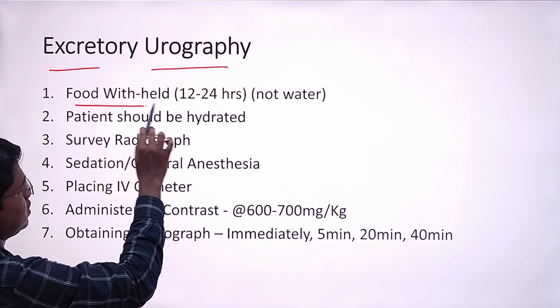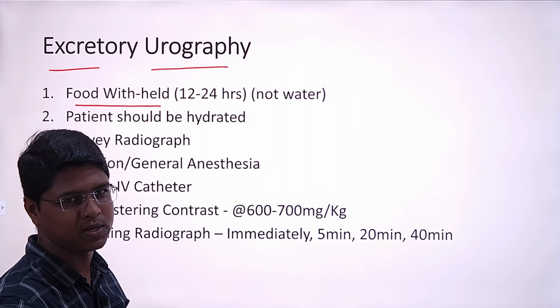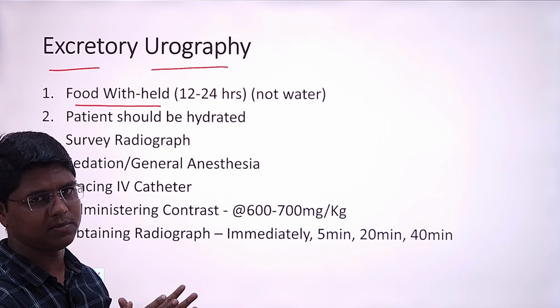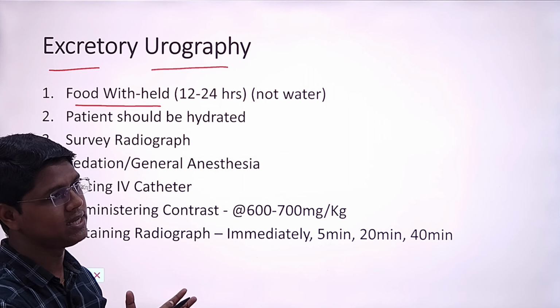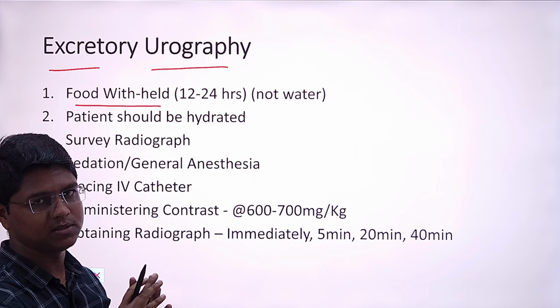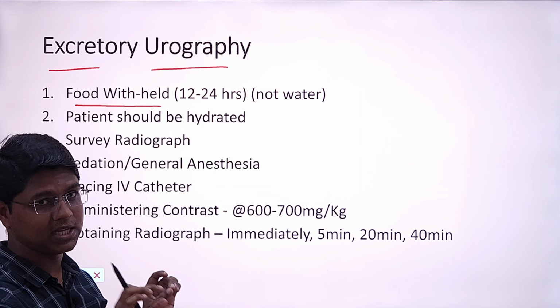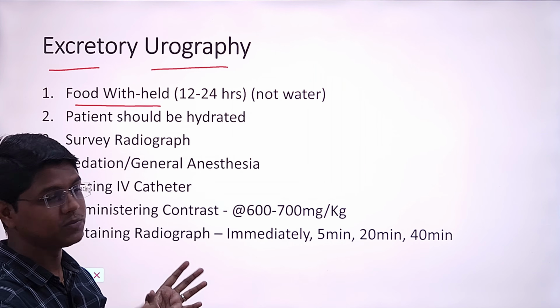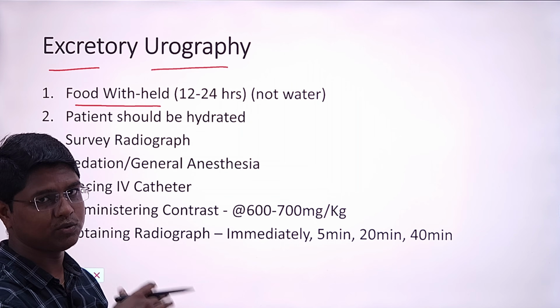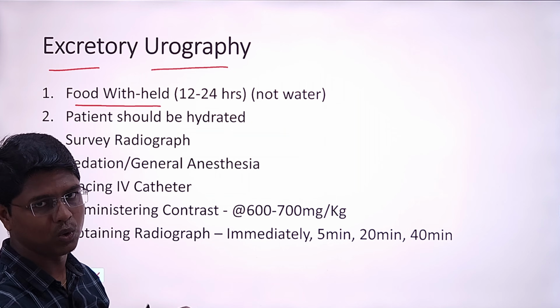You have to withhold the food for 12 to 24 hours, not water. Withdrawing food is the main reason behind that. The main reason behind this is the colons will be empty. Okay, they will not hinder any problem, especially the ureters. So that is why the food is withdrawn. If the animal has taken some food, you can use enema to evacuate the colons.